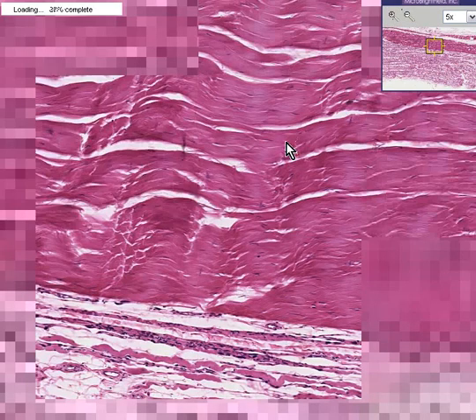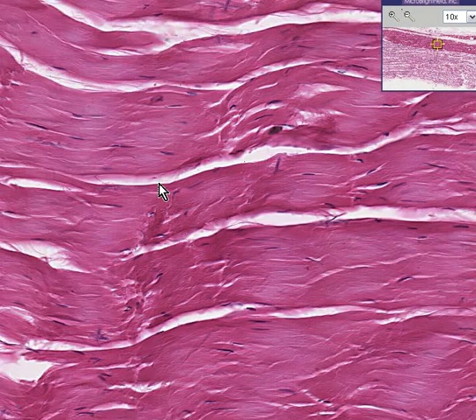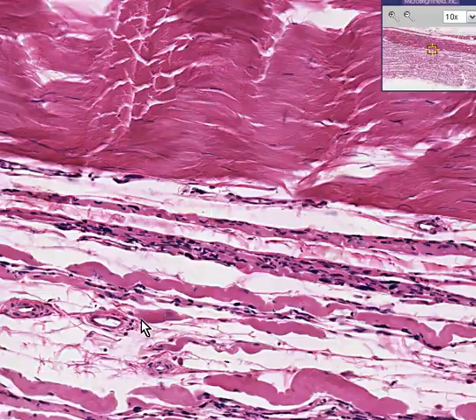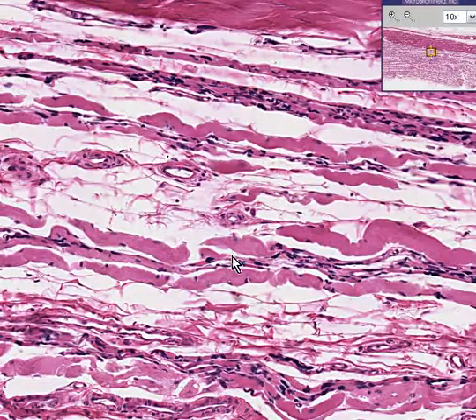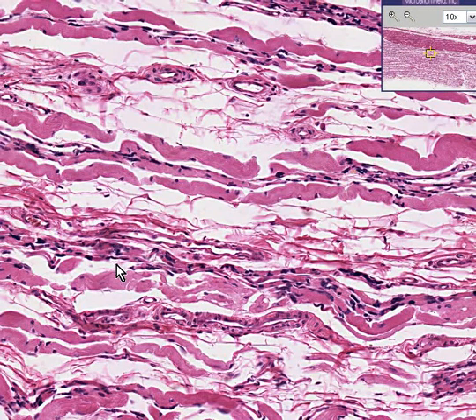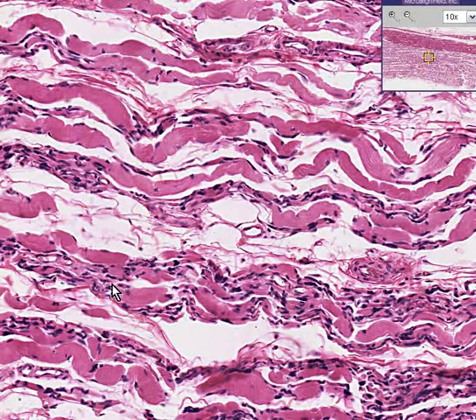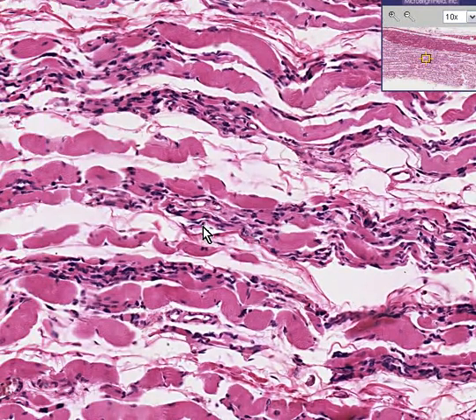Notice that in the top we still have some fibers in which, perhaps it's hard to see the striations. They're not really normal. But now in the bottom, we're looking at skeletal muscle fibers that are no longer straight. They're a little bit wrinkly. They're thinner than they should be. Sure, the nuclei are still at the periphery, like you see here and here and here and here. But basically, this skeletal muscle is being replaced slowly by fat. This is classic for atrophy of muscle, the most overwhelming cause of which is de-innervation.